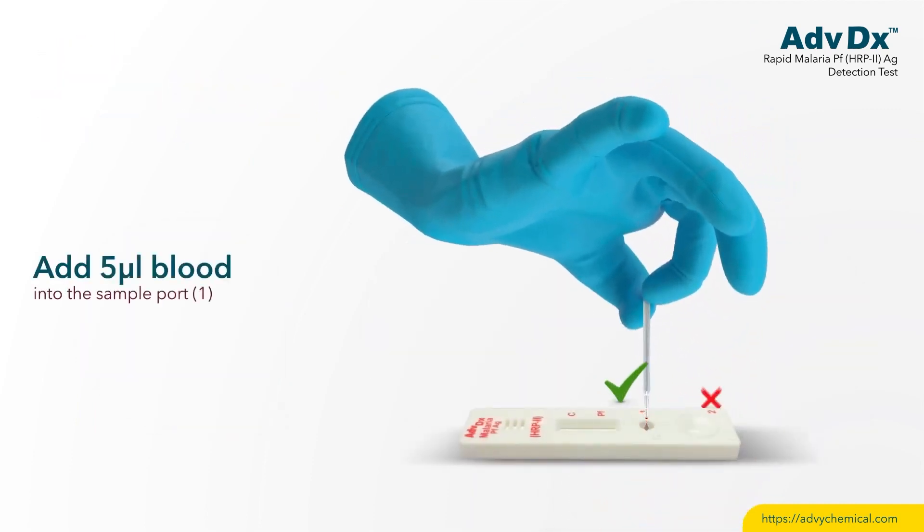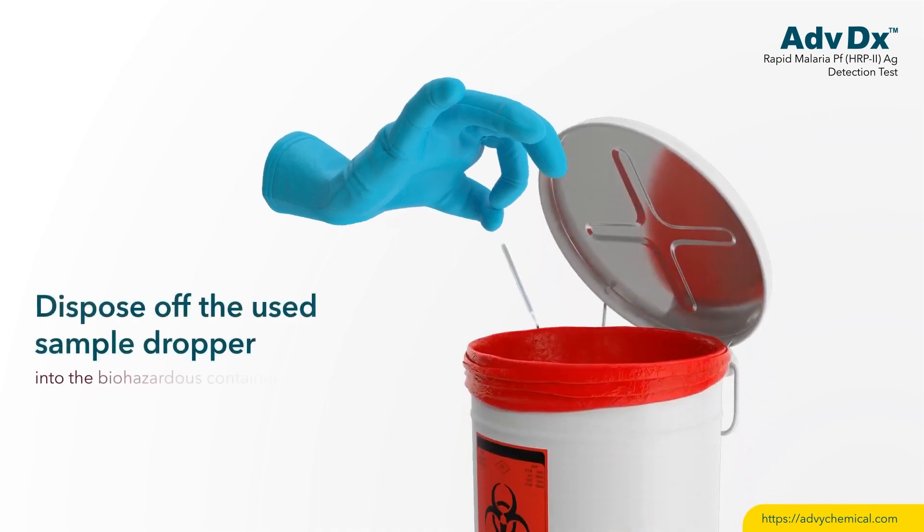Add 5 µL of blood into sample port 1. Dispose of the used sample dropper.